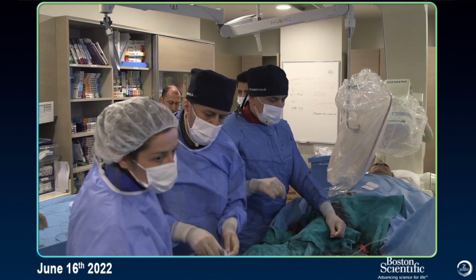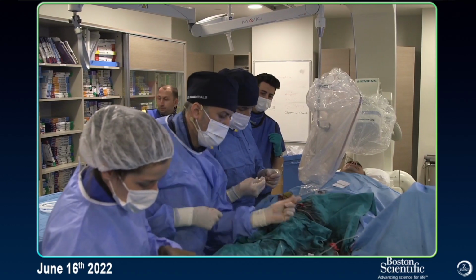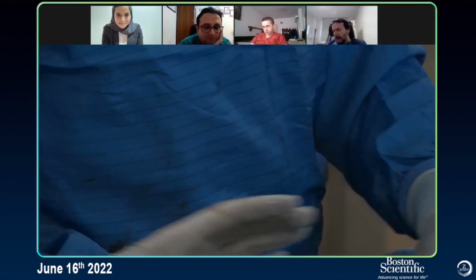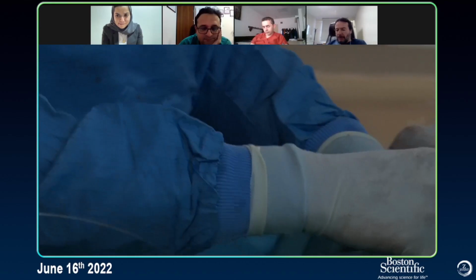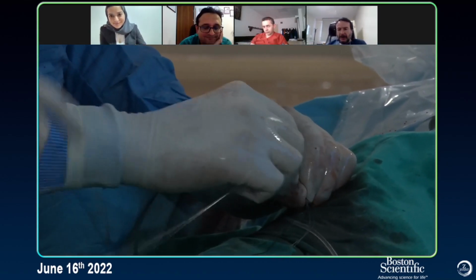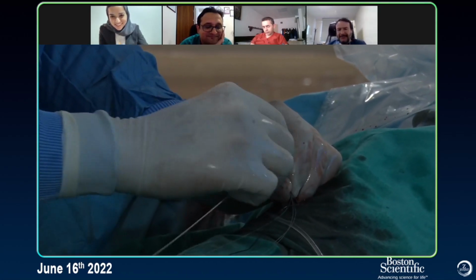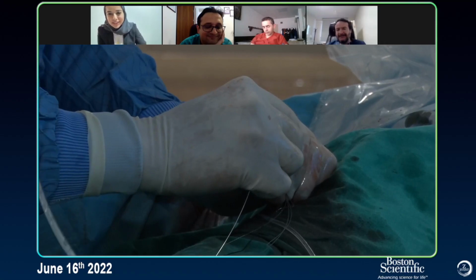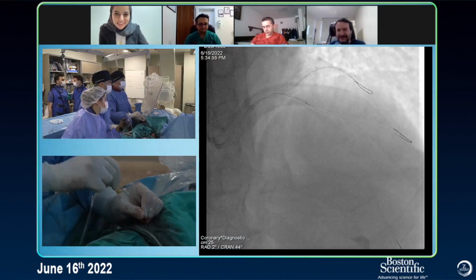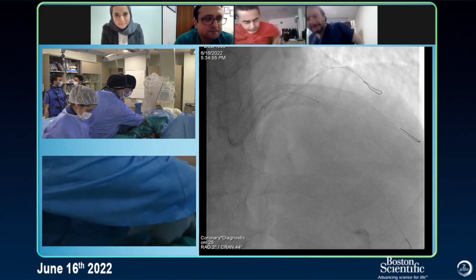But it's real life. I need this anyway for crash. Yeah, fair enough. Ömer is always a fan of anchoring balloon, and I'm a fan of Godzilla or Guideliner or something like that. I am the expensive guy. He is the poor guy. Slowly, slowly. They're extremely useful in cases like this where you're confident. All right. So let's remove.